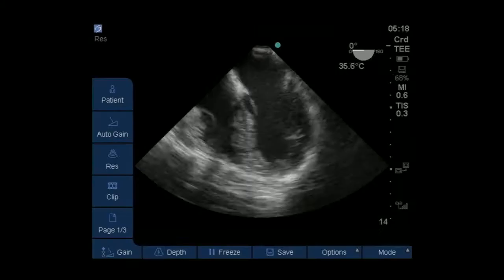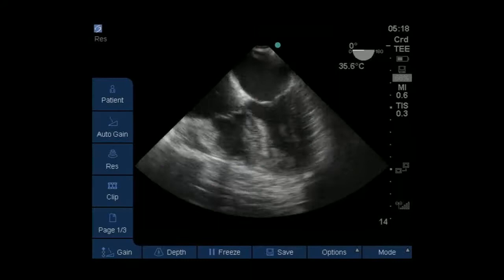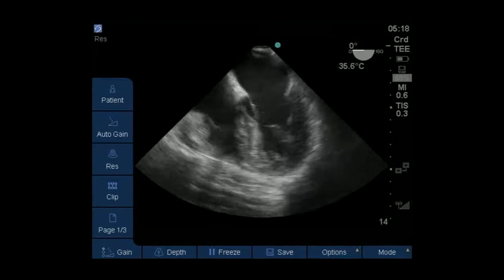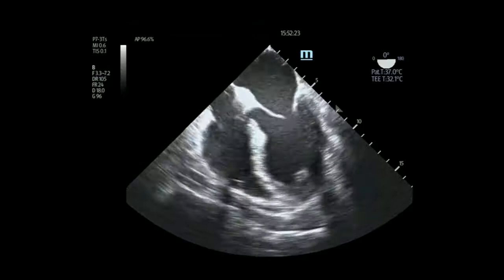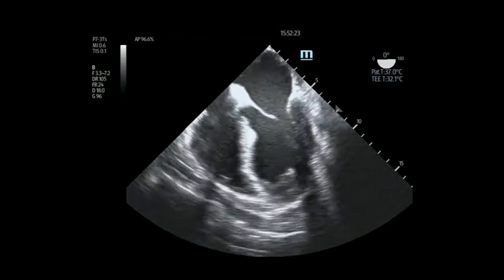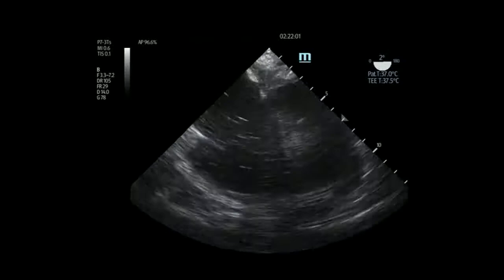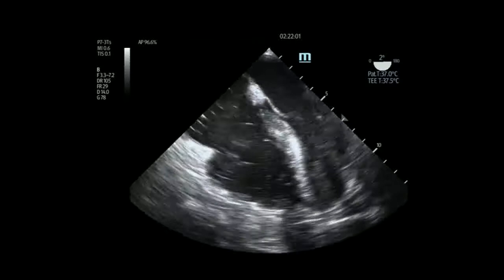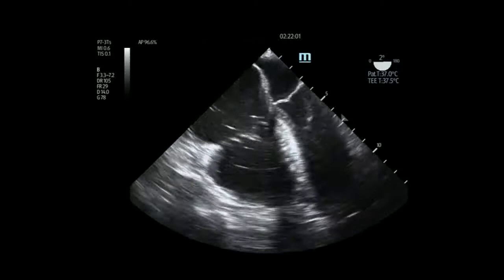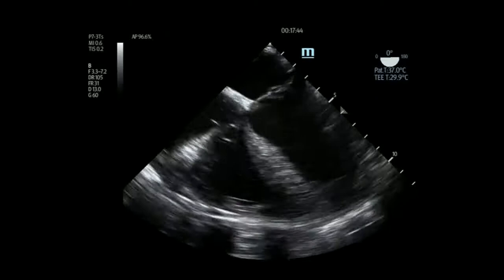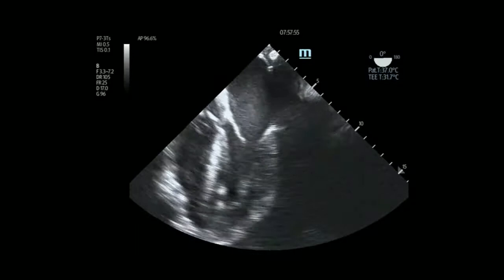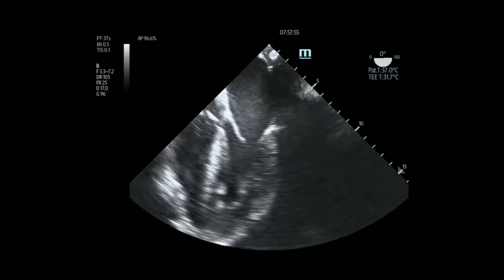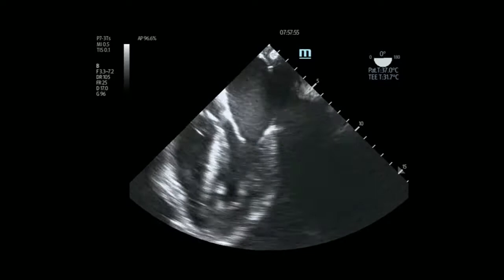Here's the first image you get when you push it down someone's throat—typically a four-chamber view, the opposite of what you would see from the apical view, just upside down. It's really easy to judge the function of the left ventricle. You're also really close to the valve, so you get a great image of the valves. Here's someone with a PE: you can see the right ventricle is bulging, much bigger than the left, and the left is very small and hyperdynamic. Here's a bad left ventricle. Here's someone in cardiac arrest not coming back because they have basically a standstill—this is PEA.